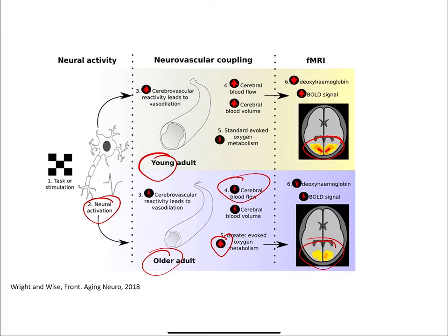Yes. Can you use CBF to regress out your fMRI data? Yeah. So one thing you can do is, if you don't have the time or the sensitivity to do the BOLD and CBF at the same time, then I think what most studies should do, although even large studies aren't doing it, like I don't think ABCD is acquiring any ASL, is it? Yeah, which I think is ridiculous. Sorry. I'll let them know. Okay, well they probably don't.